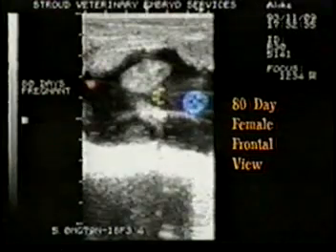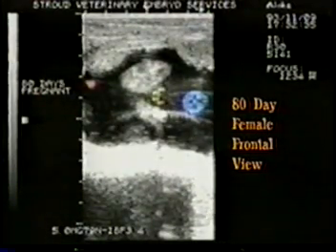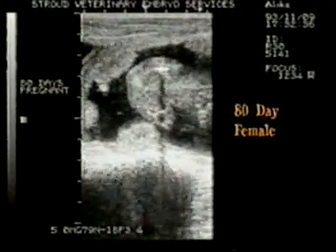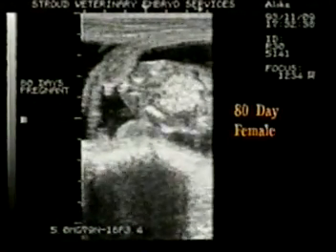There are two important features to note in this still frame. There is no penis, and the teats are protruding and well developed. Two major points have been established. There appears to be no male GT, and the teats are well developed. However, a female GT has not been observed, and it must be, in order to positively diagnose a female.